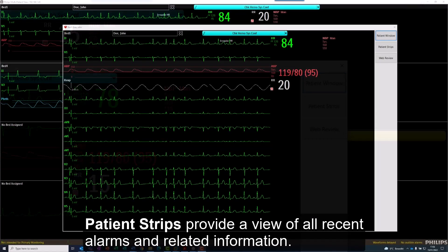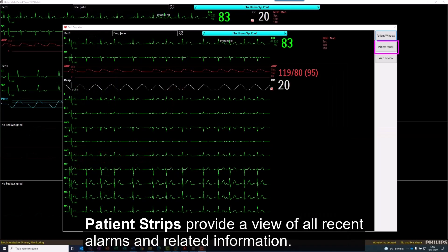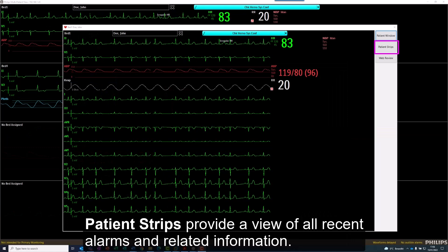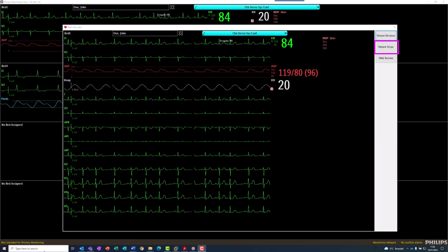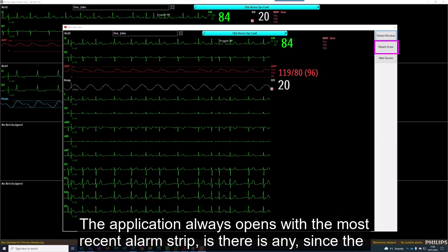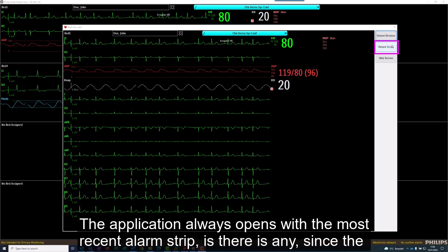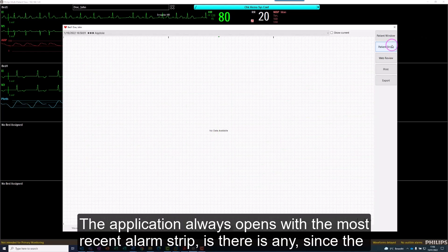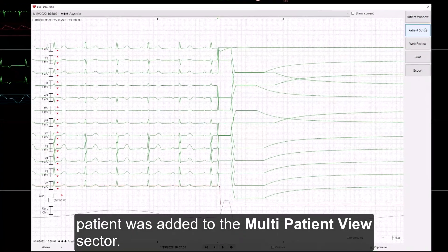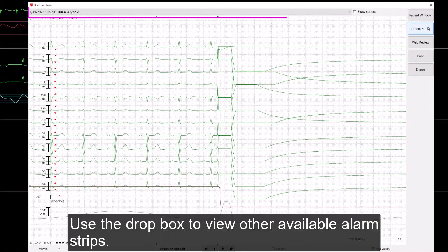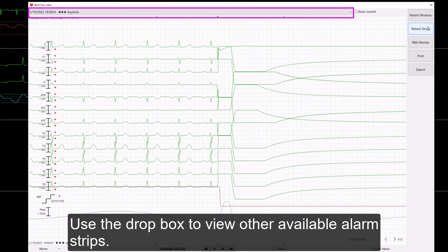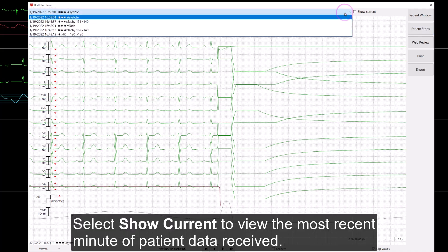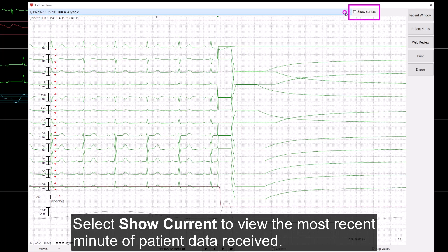Patient Strips provide a view of all recent alarms and related information. The application always opens with the most recent alarm strip, if there is any, since the patient was added to the multi-patient view sector. Use the drop-box to view other available alarm strips. Select Show Current to view the most recent minute of patient data received.